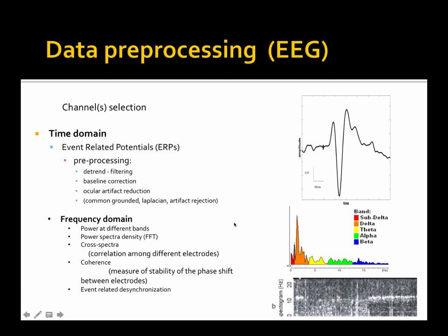Anyway, you could decide on what type of pre-processing to do, and then you can finally either try to detect one of these peaks in the data, or do some frequency analysis. For either method, you will be looking at a little window within the EEG, talking about milliseconds, hundreds of milliseconds, and you will be able to do this.